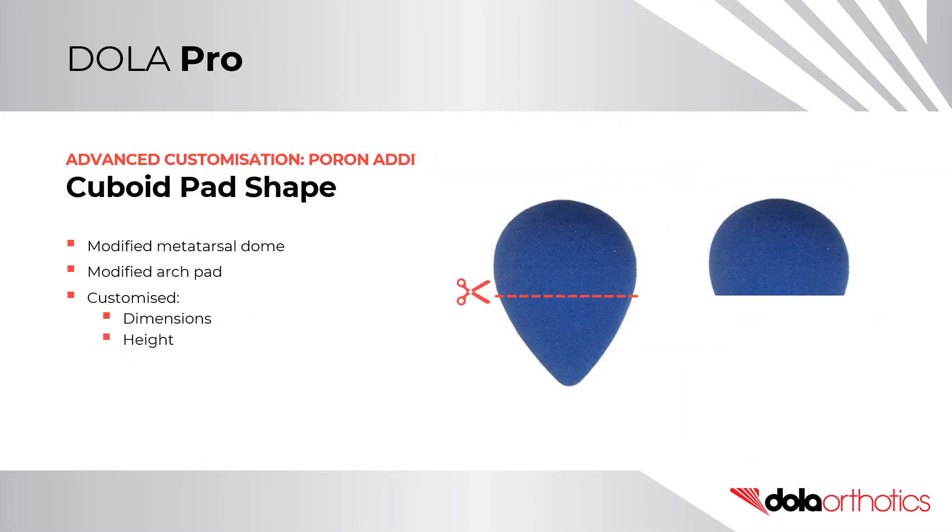Cuboid Pad Shape. The cuboid pad is a modified metatarsal dome or arch pad. From the packet it is simply customized for shape, dimensions, or height based on the pathology or anatomy. For a metatarsal dome, simply remove the tail section with scissors.